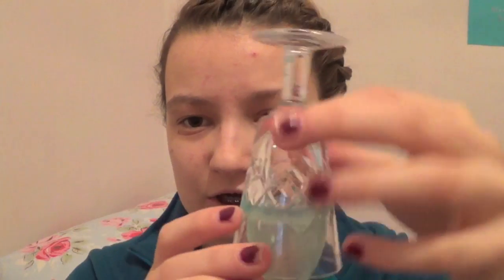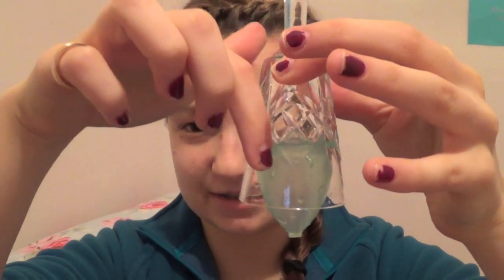But the other thing your cervix can do is it can actually drop inside the cup. So you imagine you have your cup here, you can't see very well this cup, so let's go for the lady cup. Okay, so I'm just going to set that in there. So you have your lady cup in here, and your cervix can actually drop inside the cup. This is why some people say, my cup's not full, but it's leaking.